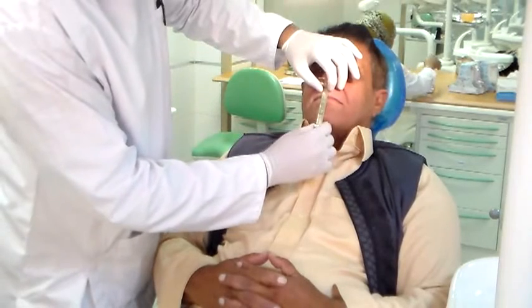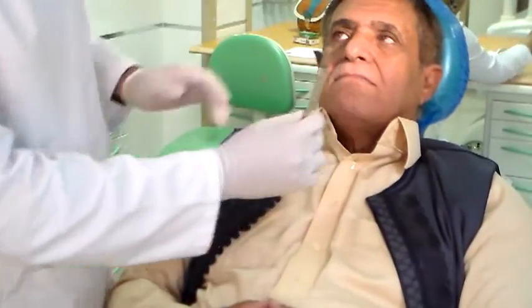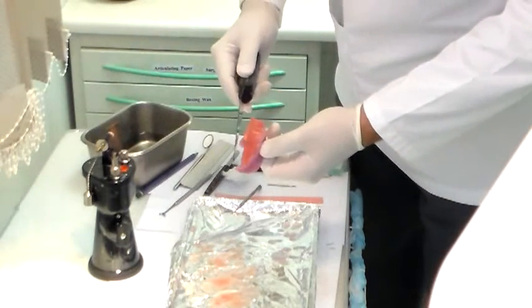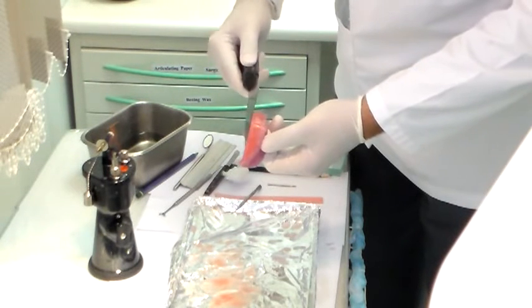So come down. Okay, now the height has come down by almost 3 to 4 millimeters. You still have another 3-4 millimeters to go. So we take this out. I'm heating my hot plate up and going to reduce this side a little further so that this side doesn't touch first.